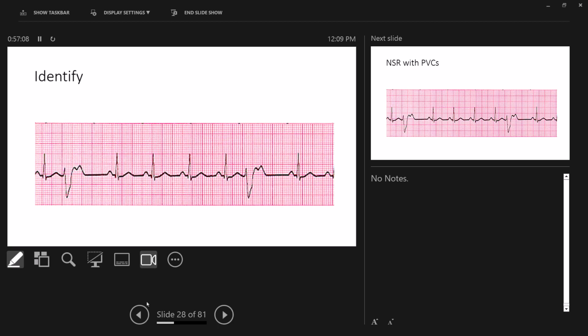So the PR interval wouldn't be regular. It's either normal or abnormal. The PR interval is abnormal? Well, normal with P waves, yeah, but there's no P waves then. Okay, so if there's no P waves, there's okay. Got you there. What about the QRS complexes? They're normal, except when they're not normal, right?